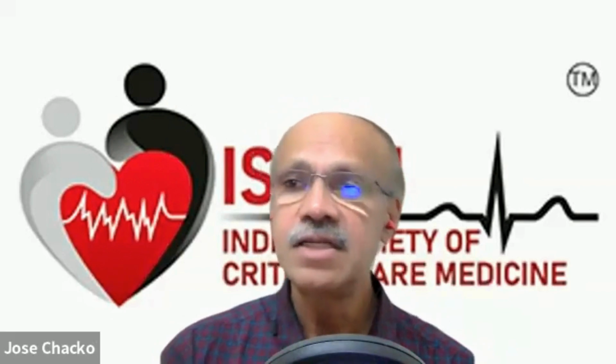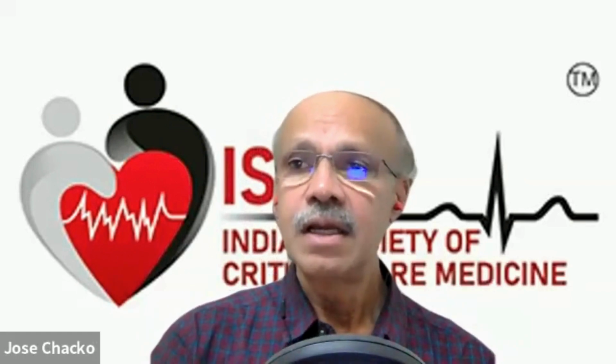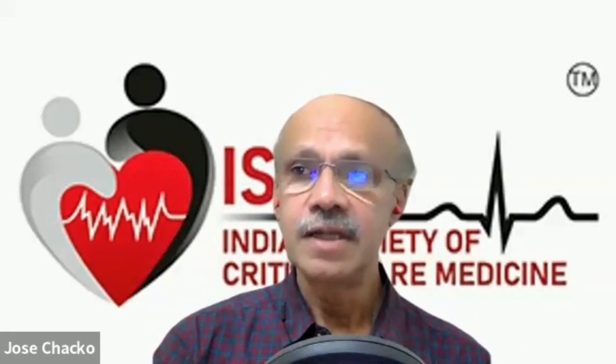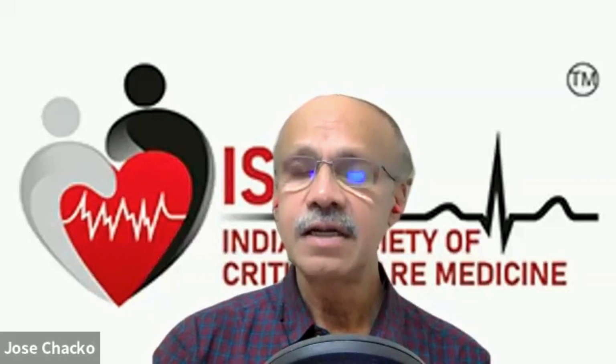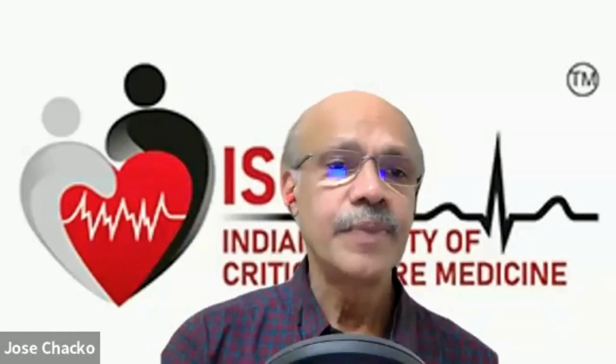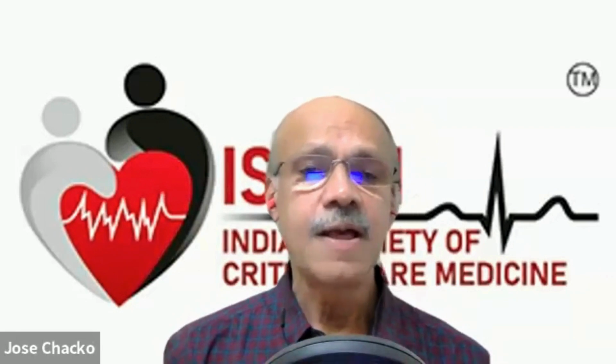So the bubble test comes in very handy, extremely easy to do by the bedside, and it gives you conclusive evidence if there is a right to left shunt at all. A right to left shunt in case of an intracardiac shunt will appear within the first 3 cardiac cycles, but if it's because of hepatopulmonary syndrome, it will happen much later, after the first 3 cycles. So that's another important point that you look for when you look at a severely hypoxic patient.